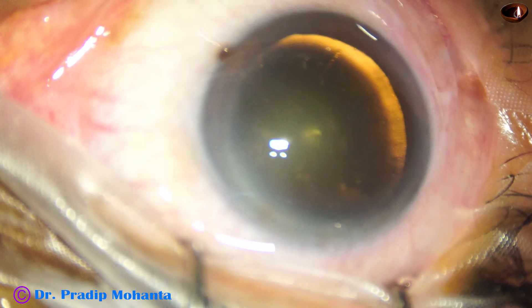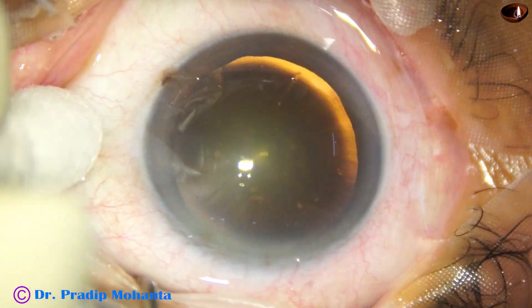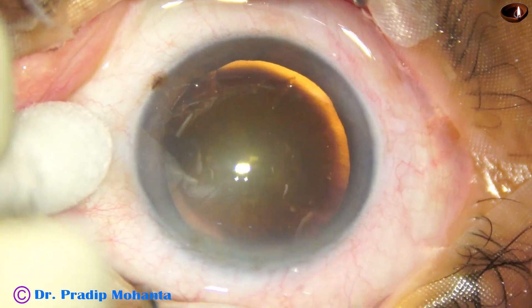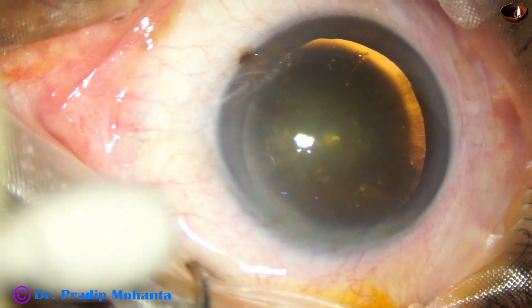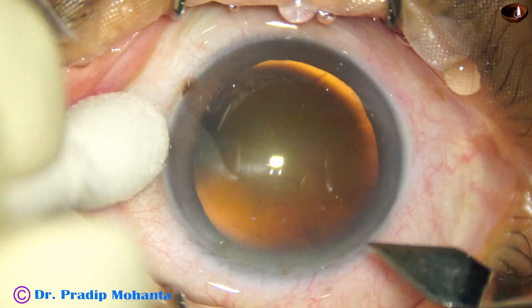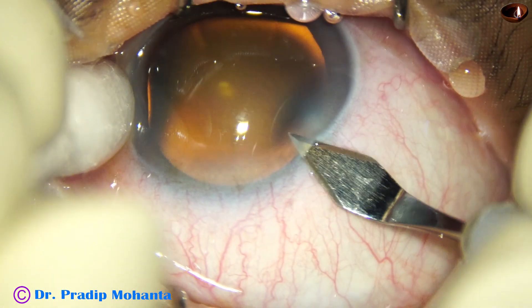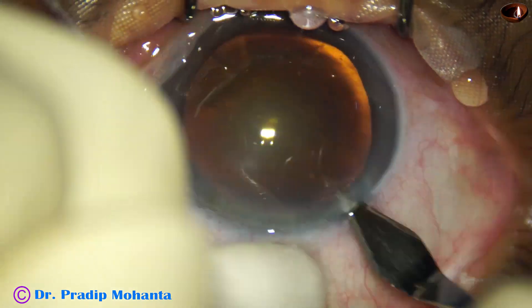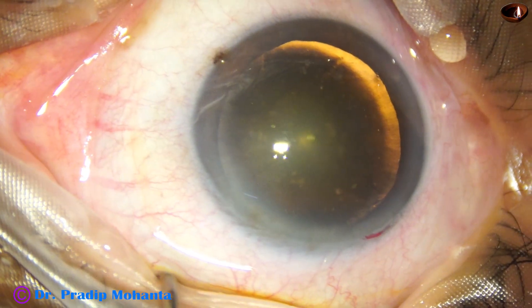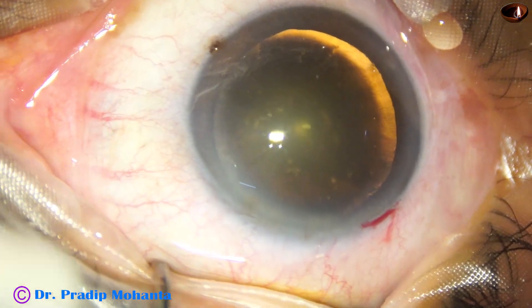Let us observe this totally unedited surgery. You can see that the eyeball has tilted to the right side. This is because of peribulbar block. Sometimes one muscle is more paralyzed than the other, and because of that the muscle which is not much paralyzed acts and the eyeball is pulled to that side.